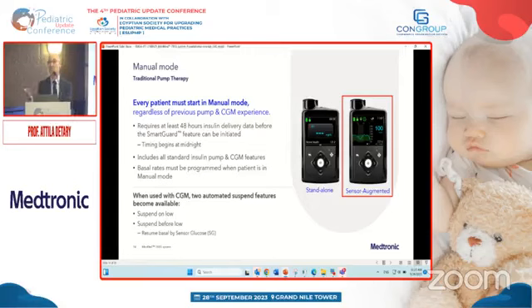For example, it helps me calculate the basal rate I should set in the pump. So 40 divided by 2. Usually half of the delivery is in basal, the other half is in bolus insulin. So let's say that this is 20 in basal. I divide it by 24, it's roughly 0.8 units per hour. So this is my hourly basal I should program in the pump.